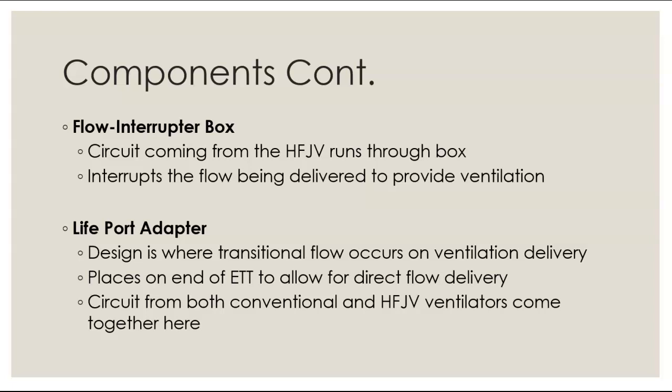The life port adapter is designed where this is where transitional flow occurs. The shape of this life port adapter is what allows this to go from laminar flow to transitional flow for that jet effect. We place it on the end of the ET tube. You'll put it instead of the hub that might normally be there. How we remove it, because this is where we're going to attach our life port adapter, is the very, very end of the ET tube. It's able to fit directly on there. The life port adapter is also where both the conventional and high frequency jet ventilators come together.